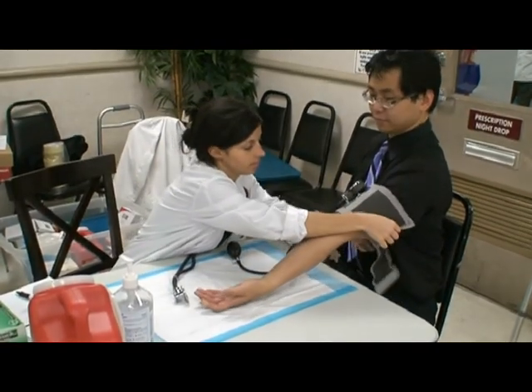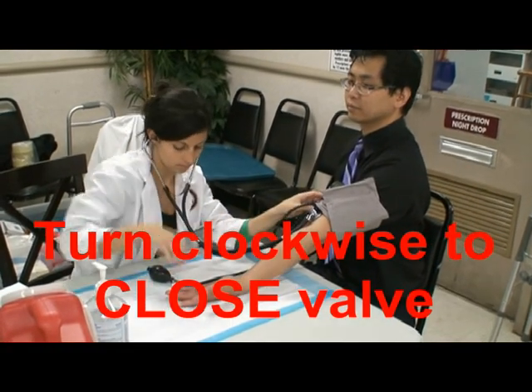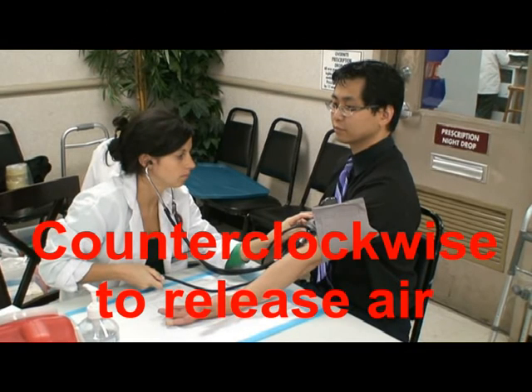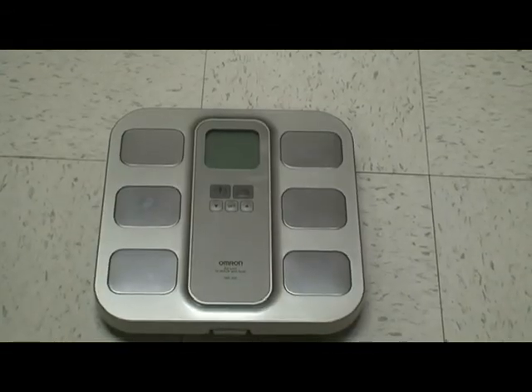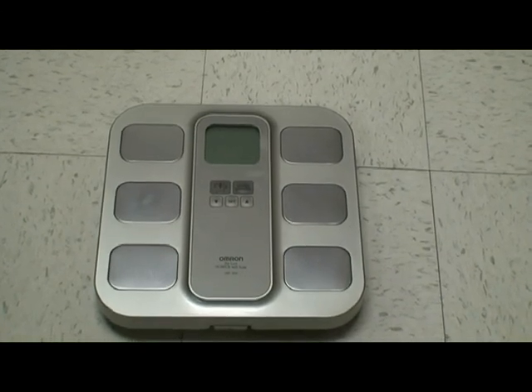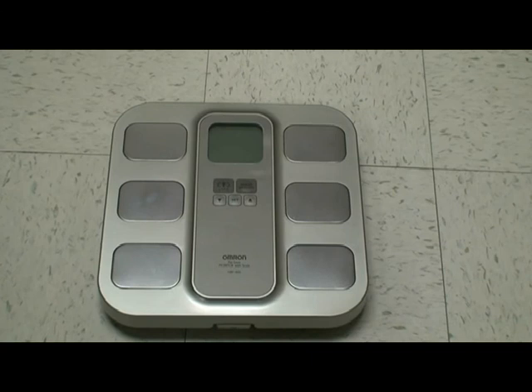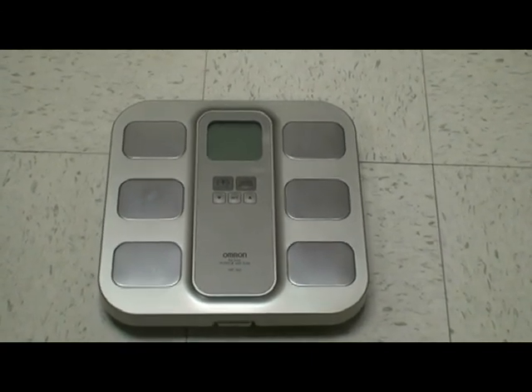For the manual, the cuff technique is the same as the automatic. We want to make sure that the valve is turned clockwise all the way and slowly released counterclockwise to release air. So the third part of the screening is the weight evaluation based on BMI and percent fat. So we're going to show you how to use the scale.